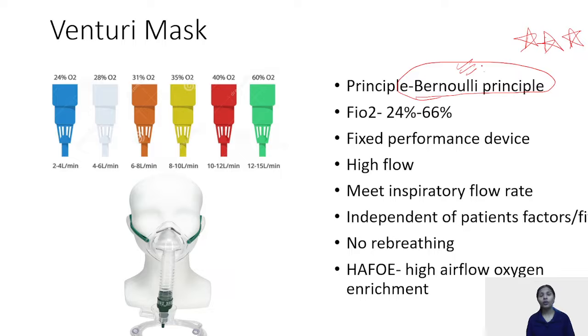Now, what does Bernoulli's principle state? Suppose a liquid is coming at very high velocity. Then a constriction comes. Suddenly we have a constriction, and all of this liquid has to flow through it, and thus the velocity of the liquid increases very high.